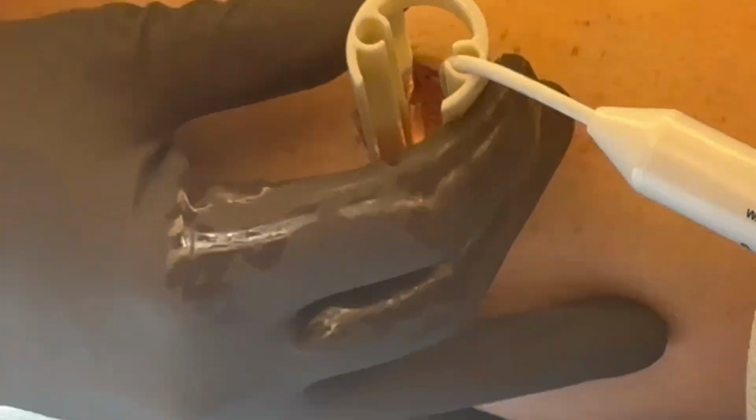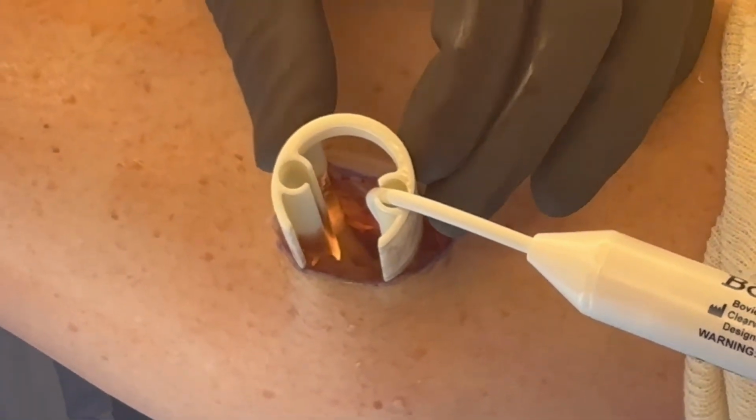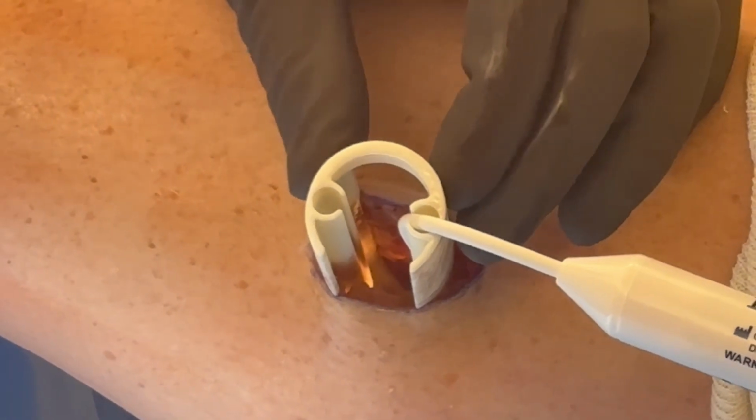And now the light source can go in either hole within the cannula. This is a real game changer for me. It really provides significantly better visualization within the fascial layer of the gastroc and soleus.